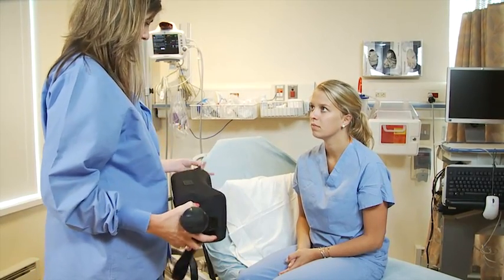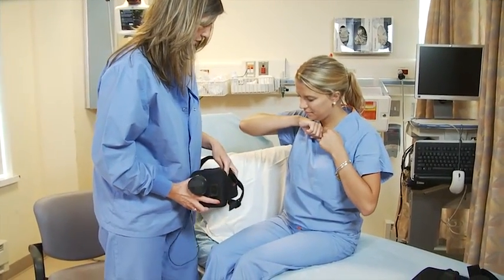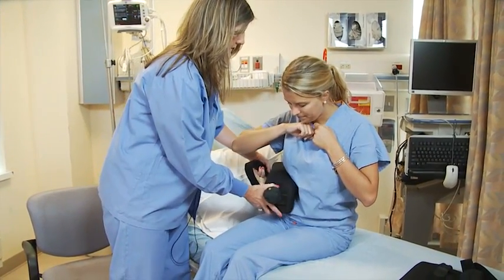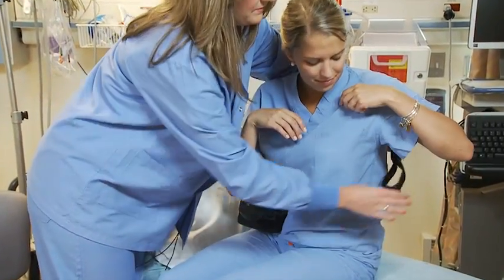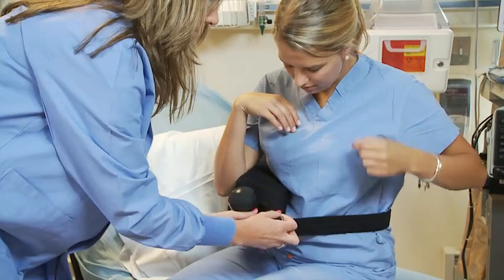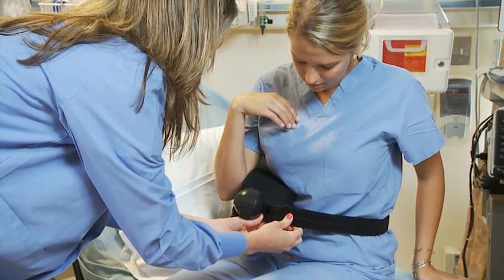First, what you want to do is just fit yourself with this first. This is just going to go alongside your waistline. This is being fitted for your right side. It's just going to go around your waist and there's a little buckle here. I'm going to snap it in place.